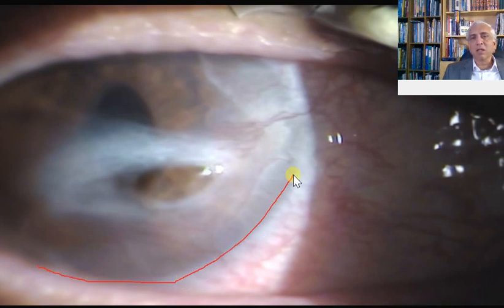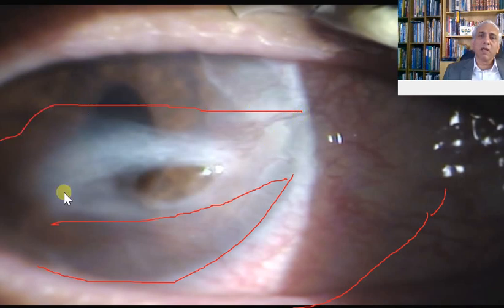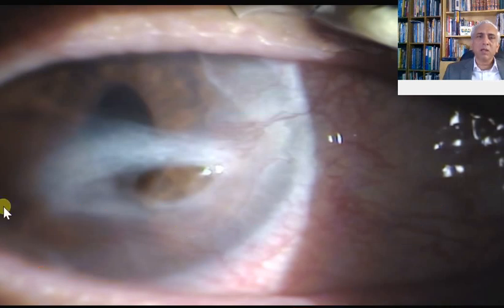So you would give a cut in the conjunctiva over here, and then give a place over here, and then make a cut over the conjunctiva over here like this. And once you've cut this, the conjunctiva becomes mobilized, and you can put it as a bucket handle flap over here, and then you can suture it over here in this area. So if I remove this, what will happen is I'm left with a conjunctival flap which is covering from this area to this area, and you would suture that flap in place.